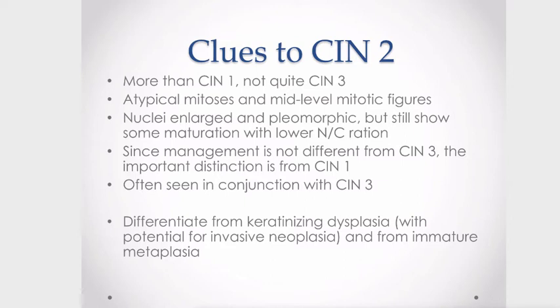Now, another thing to remember is that CIN2 is often seen in conjunction with CIN3, and so you want to make sure you look carefully to make sure you haven't got an area of CIN3.